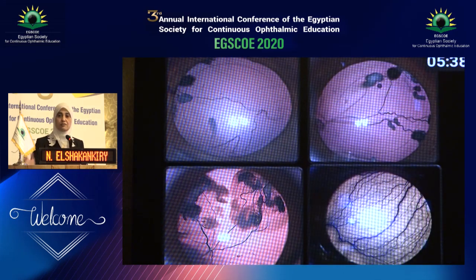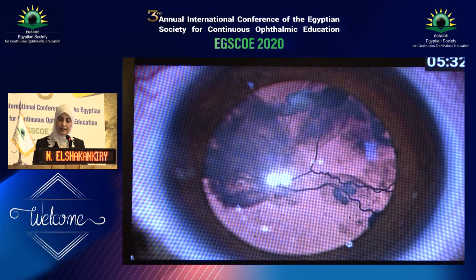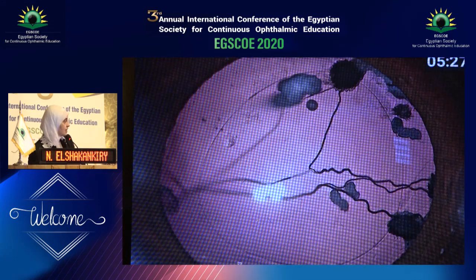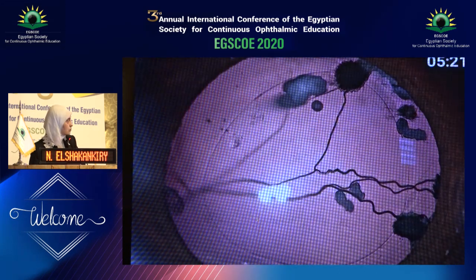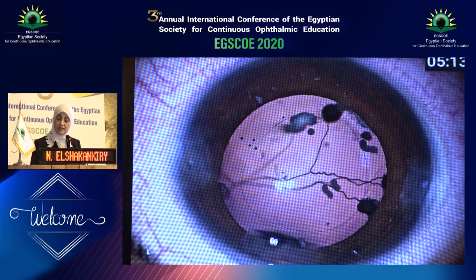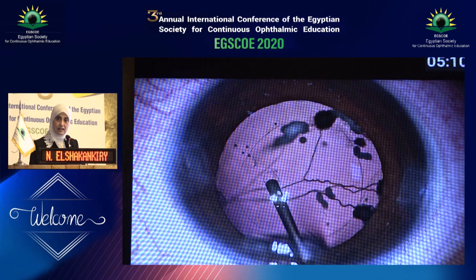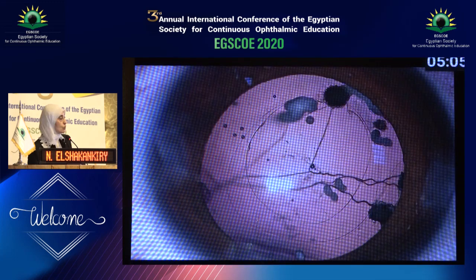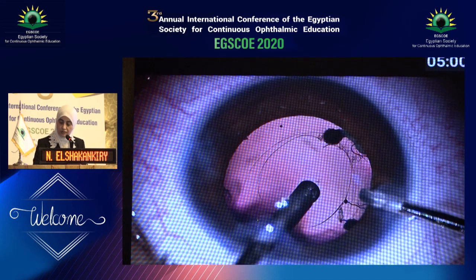Sometimes the membrane is only vascularized, no fibrosis, only vasculature like that. During surgery, after irrigation aspiration, look here at the blood vessel. Here it is empty, and you can see the blood trickling here in the blood vessel. Still, we can perform posterior capsulorhexis by hooking, tenting, tearing, and then injection of viscoelastic into the Berger space, and then performance of the posterior capsulorhexis totally separable from the vasculature. And then eat up the vitreous and the vasculature.